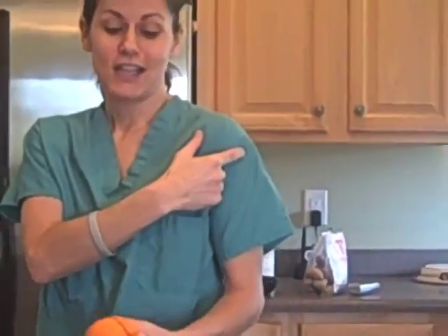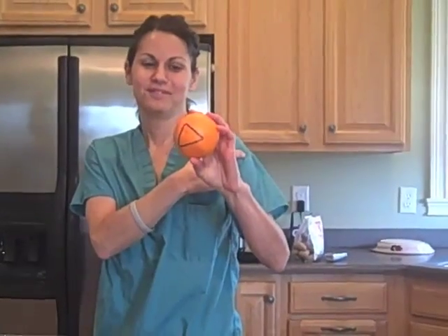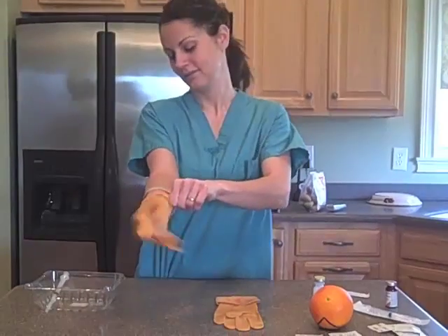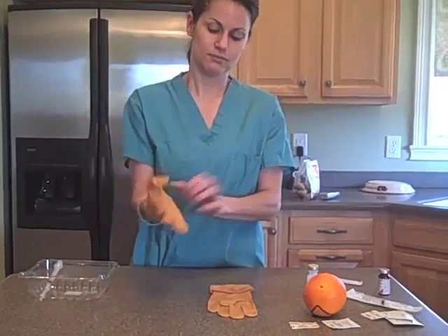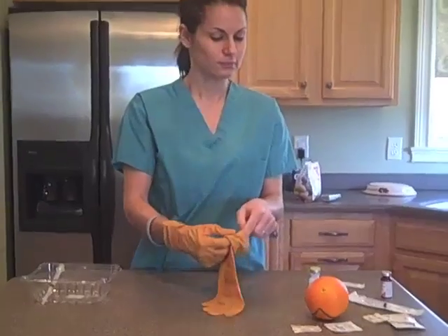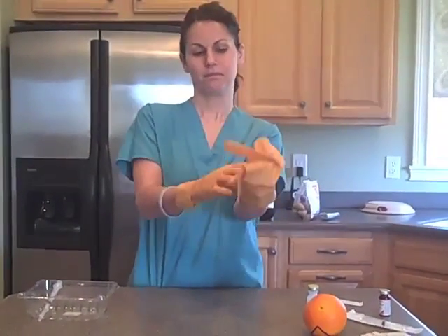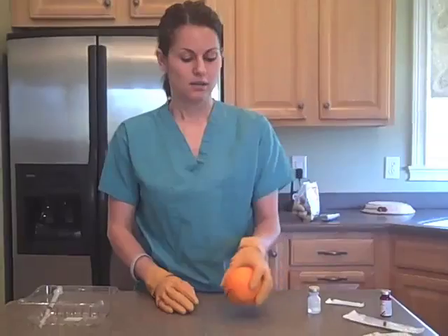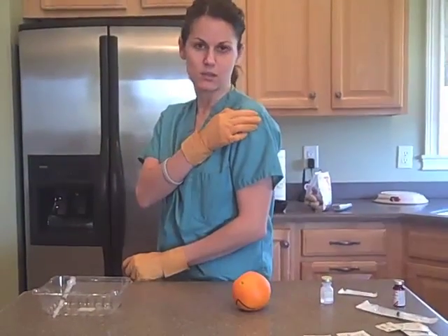For the purpose of this video today, we're going to use an orange. Most nurses use oranges when they begin to practice giving IM vaccines. First, the nurse is going to don her gloves, which means put on her gloves. We then find the appropriate place to place the vaccine, as we just mentioned.